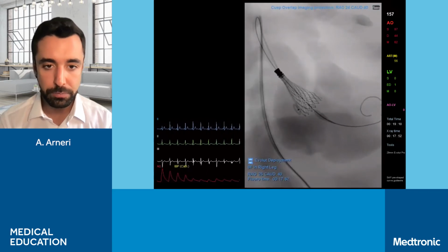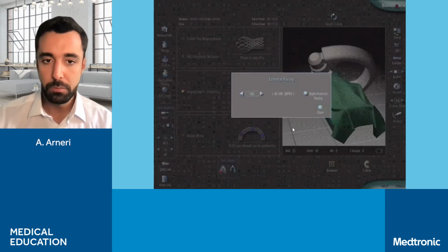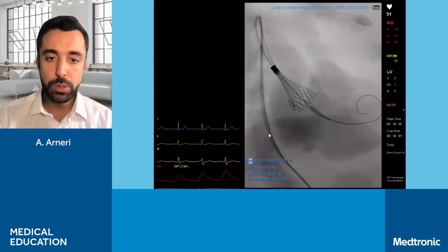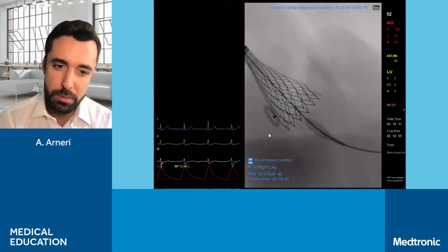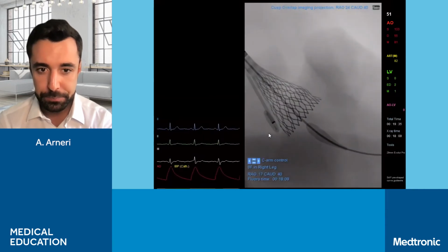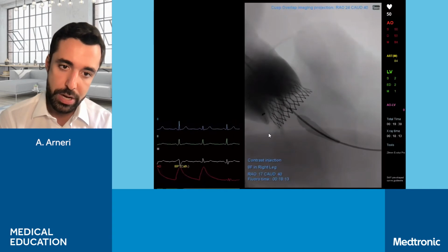Okay, we stop here now. We stop also the pacing. What I will do now is zooming a bit more. We can also maybe go a bit less RAO to remove some parallax. Okay, perfect. And we can do a contrast injection now.